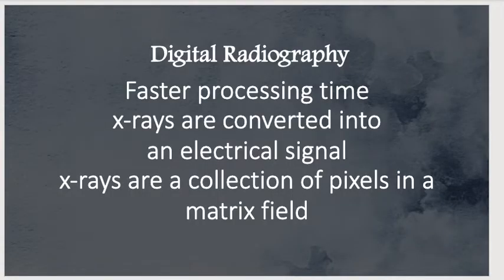In digital radiography, an image is a collection of pixels, each of which is assigned a numerical value that is determined by the relative attenuation of X-rays passing through the corresponding volume of tissue. Only in digital radiography will you see the use of charge coupled devices, which help to illuminate areas that have low level visible light, and thin film transistors, which are charge sensitive devices that collect electrons.